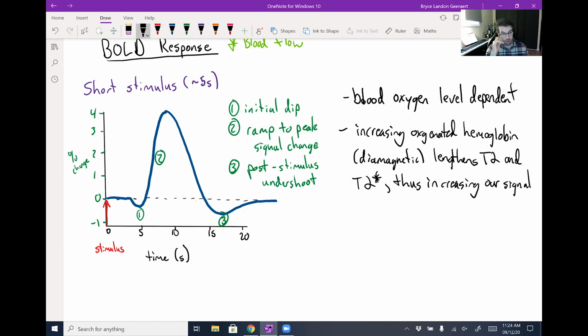We're looking at an increase of signal based on changes in blood flow and using that to infer brain activity. It's worth noting that this is only a couple of percentage points of change, so it's easily outweighed by noise, and we can combat that, which we'll talk about a little bit later. But it's important to realize that fMRI is susceptible to the effects of machine noise, which is intrinsic to MRI, as I keep saying.